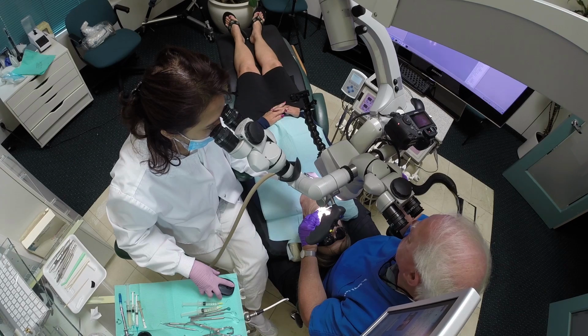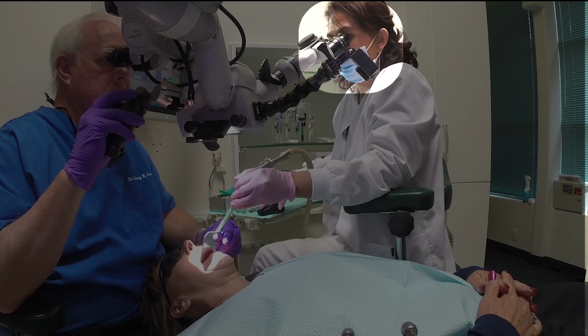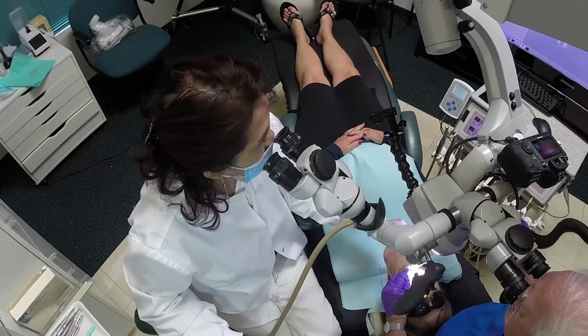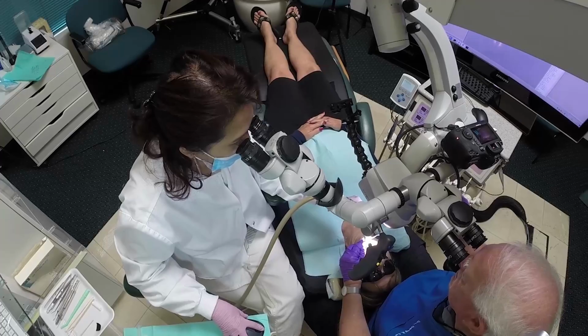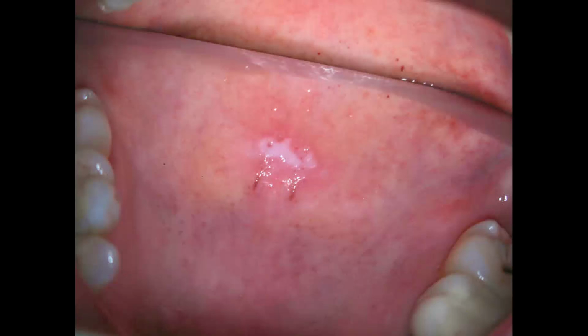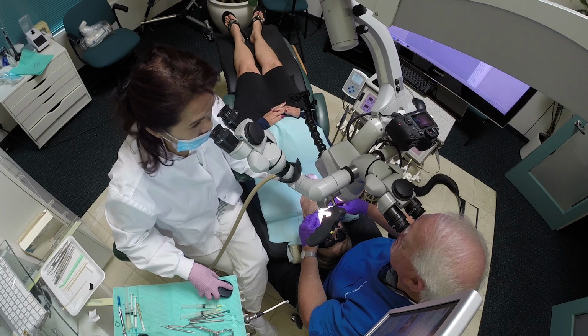Again, notice her eyes. She looks up, she looks down. I'm telling her when I want the picture taken, but she's actually determining that by the fine focus that she can see through the scope. There's another picture that she took, and now she's going to bring up a picture that we took several weeks ago of the same patient, and we're going to be able to compare them while we work contemporaneously. That's from 2 weeks ago, and now we have the series of pictures that we took today. And that's the last one today.